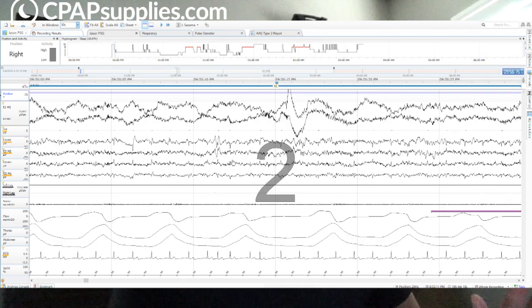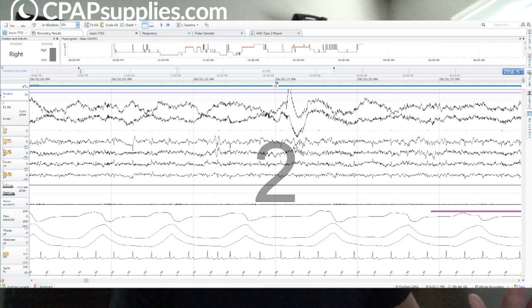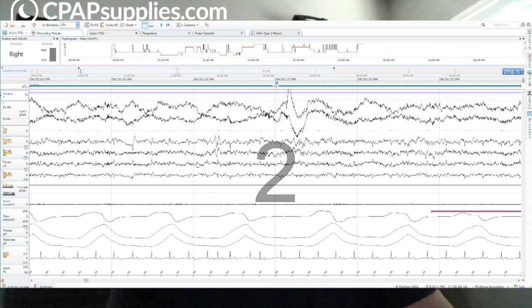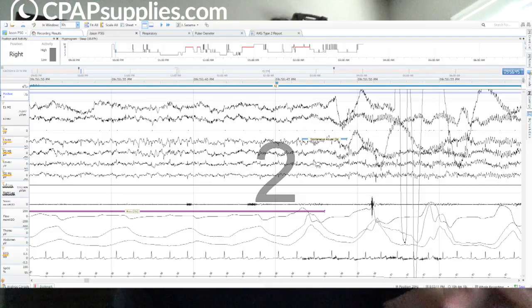We'll get over here, stage two. Why? Because there is a K-complex right there. K-complex or a little caterpillar looking thing, which is a sleep spindle, that would qualify it to become stage two. We have a sleep spindle. We're good. Okay, this is the first thing I want to stop, collaborate, and listen. Just kidding. This is the first thing I want to show you, and that's RERA.